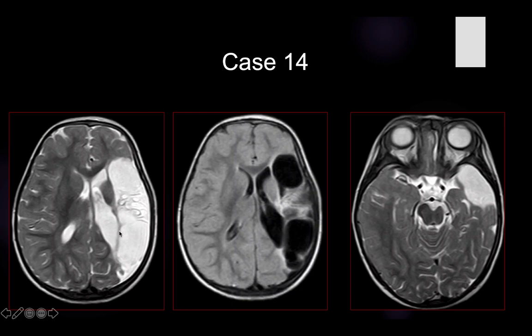Okay, this is an area of encephalomalacia that is seen surrounded by an area of high intensity, which represents gliosis, and is associated with ex vacuo dilatation of the ipsilateral ventricle. So this is an area of encephalomalacia, usually of a previous insult. And if you see here, it is also extending into the temporal pole. This distribution corresponds to the territory of the middle cerebral artery. So this is an example for a left MCA chronic infarction.